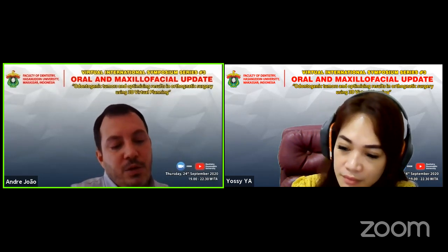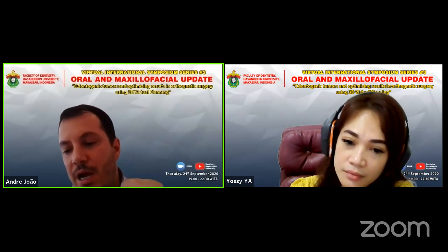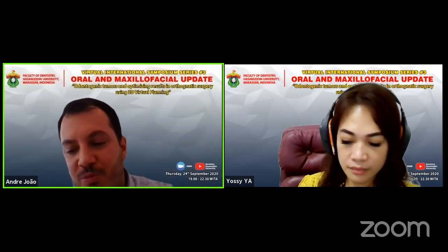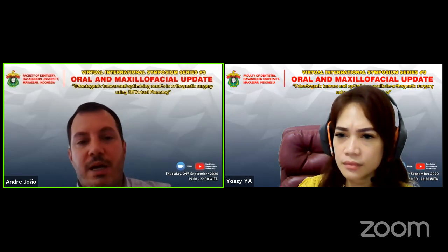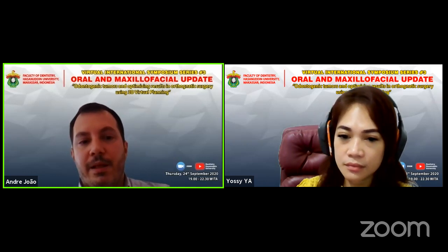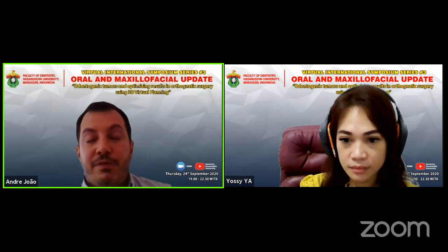For instance, when I'm taking the dental impression, if I commit some error during the dental impression or during the creating the model or taking the face bow, if I put the articulator in a different position, I'm going to have problems during my surgery. So in 3D virtual planning, I don't have this, but I have others errors.